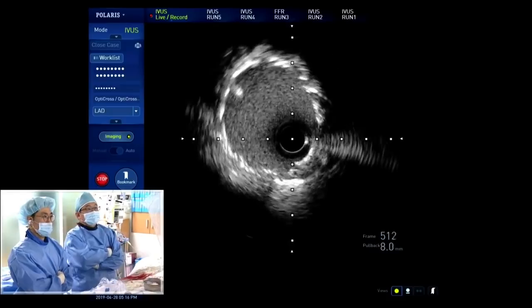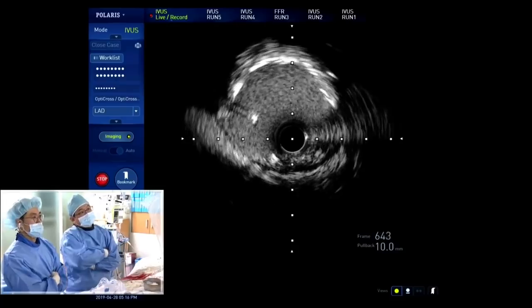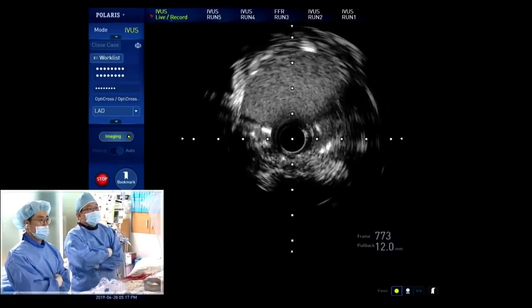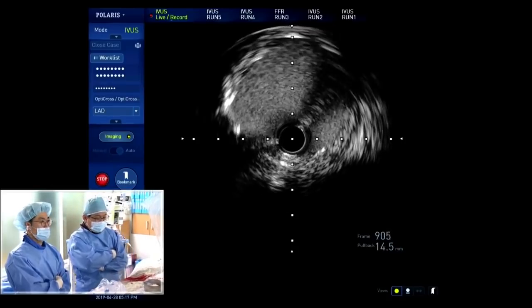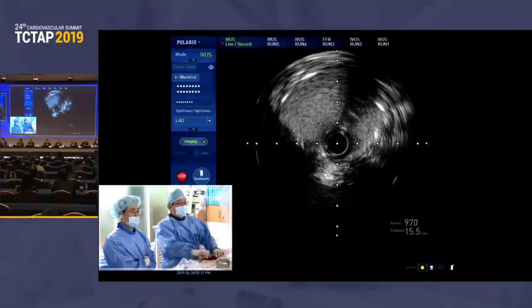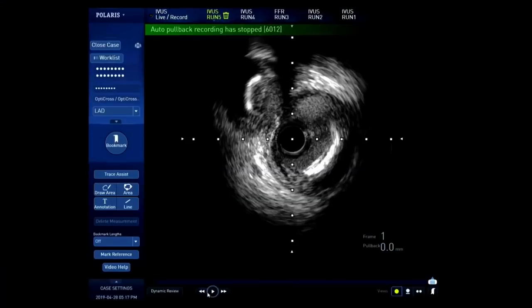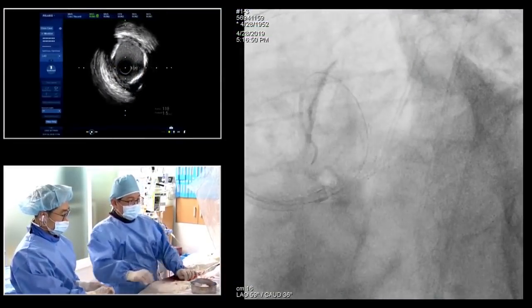If you don't remove the socks, the shoes almost don't go in. 3.5 minimal stent diameter, maybe more than 10 millimeters square. But I think it's big enough. Center position is good. Okay, stop please. I'd like to see the ostium. Okay, this is the main interest.